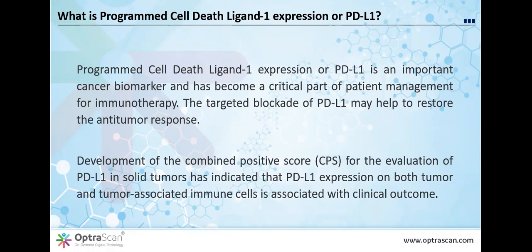We are, most of us, in lockdown, and so the technology we're talking about today has suddenly found new and important application, as we are in fact forced in many cases to sit away from our usual hospital environment and still render diagnoses.